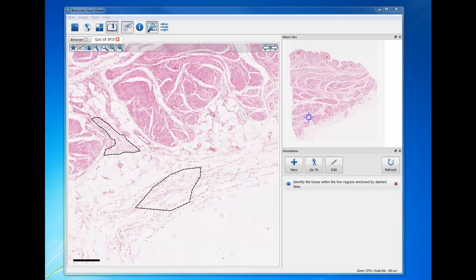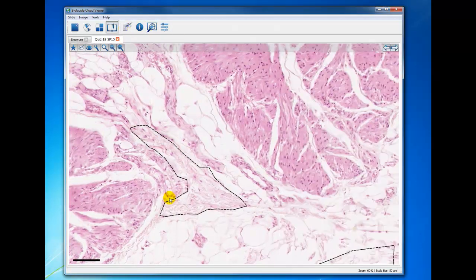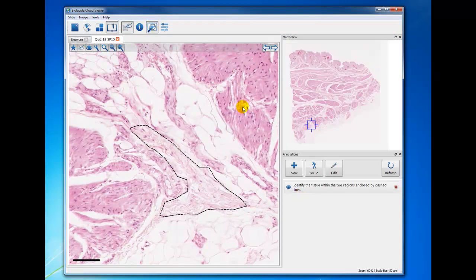The second is that when you are looking at a specimen initially, you may not see the annotation, you may not see the macro view, you may see this. I hope all of you know by now, but in case you don't, the annotation button displays the question, and the little magnifying glass displays the macro image. So that's a tip.